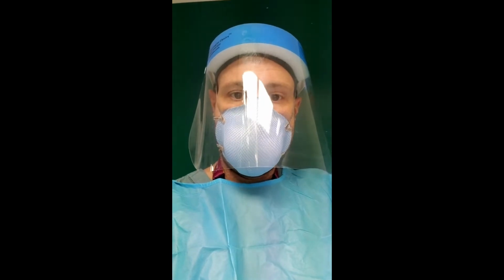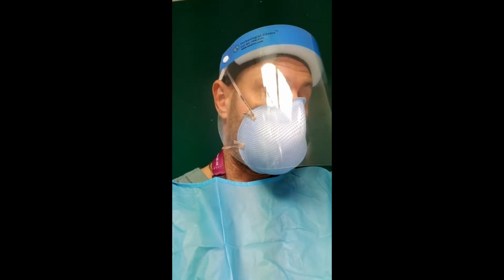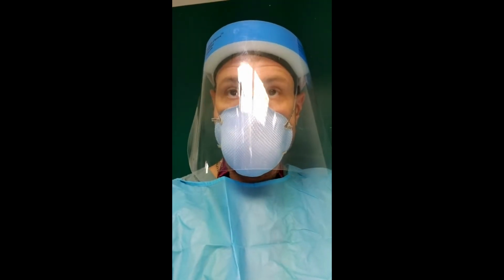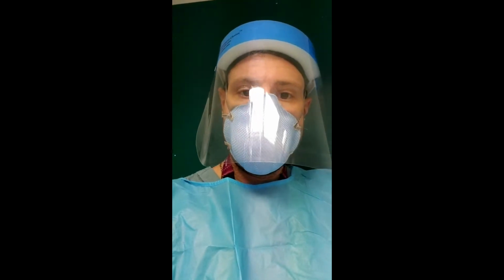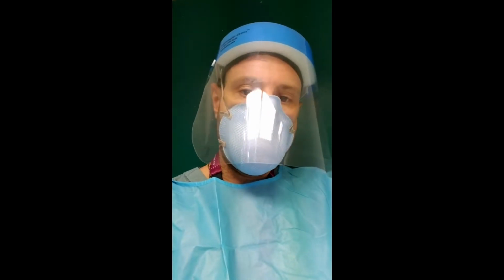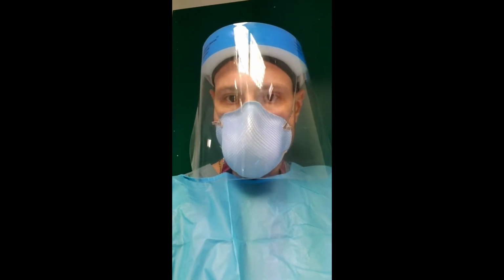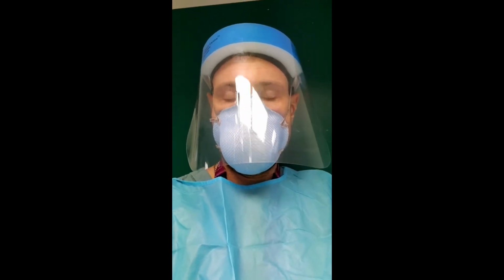We've weaned down to 70%, which is great because we were at 75 and kind of stuck there. Patient's saturating 93, 94%. So already within probably an hour of being prone, we're seeing 5% less than when the patient was on his back. Sometimes with APRV, especially when changing position, or when you start APRV, it can take anywhere from 8 to 12 hours for recruitment to occur. It's not a mode where you put it on quickly and say, no, the SAT didn't improve. You need time.